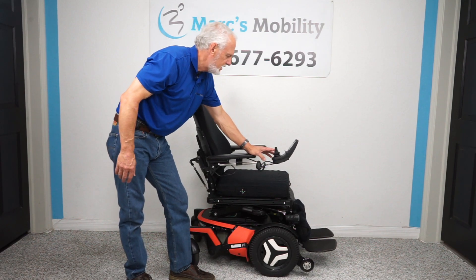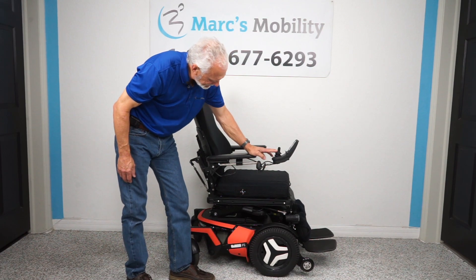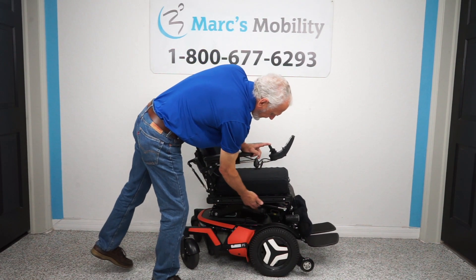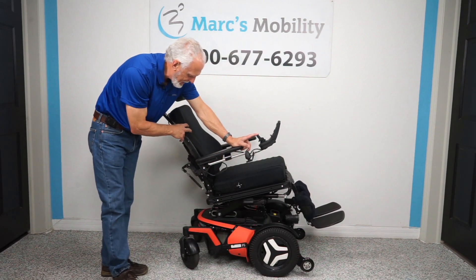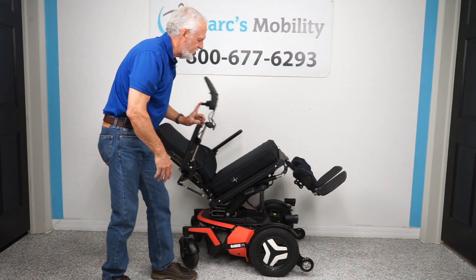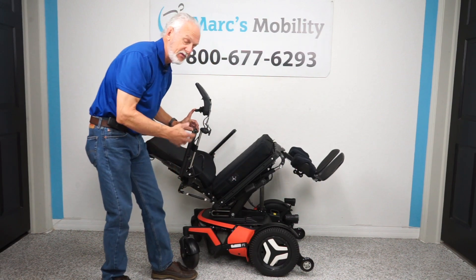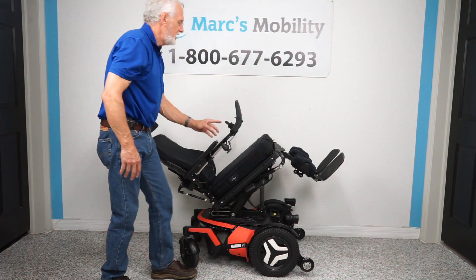The next feature is the electric tilt. The electric tilt is when the bottom seat base goes back — and of course it takes the legs and the back with it since they're all connected together. This is good if you need to relieve pressure off your bottom and back — there are a lot of medical benefits to tilting back.